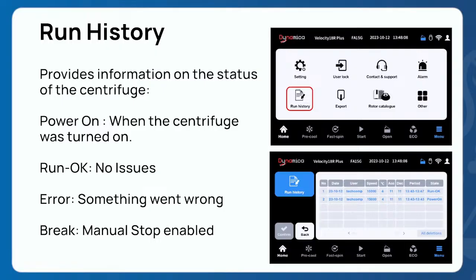So as a supervisor, you could come along, get yourself to that run history screen, and quite quickly identify what the problem was, at what time, and what error was given by the system. Further, you can check the status of whether the run is okay or not. If the run is okay, it will show okay. If something is wrong, you will see what's wrong. So it identifies the error and lets the team work out what they need to do to correct it.